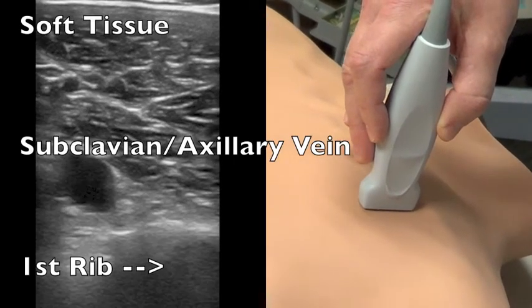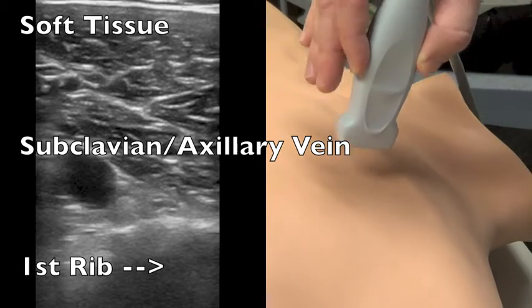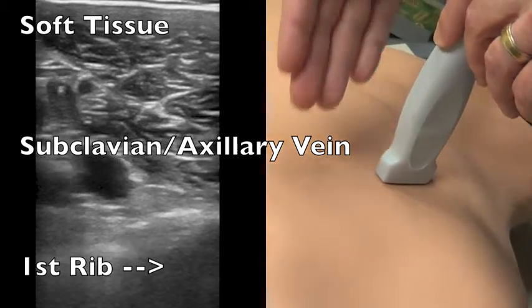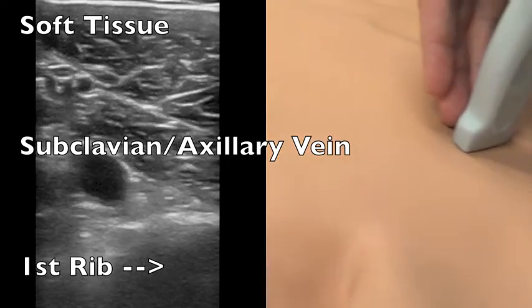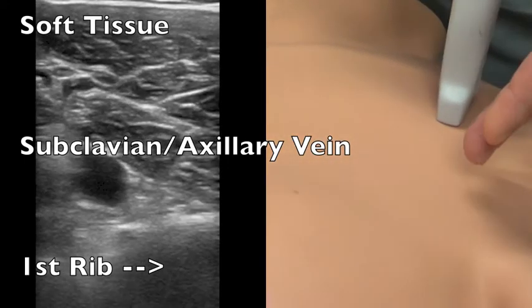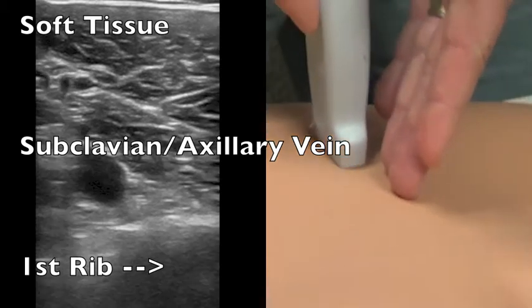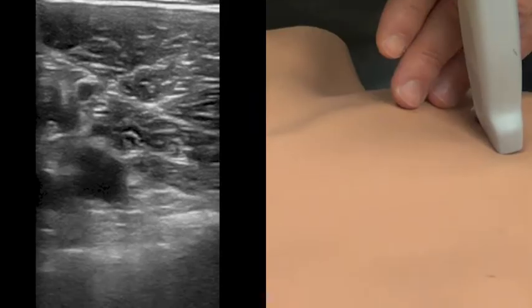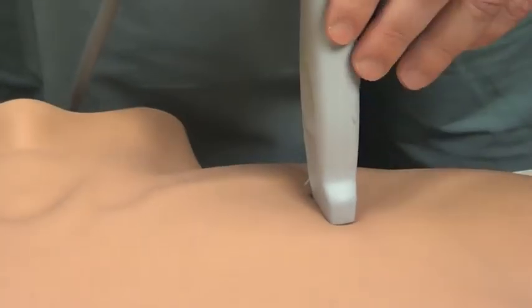I like to view the vessel in the short axis view and I usually end up with the probe in the infraclavicular fossa — in the area between the lateral aspect of the pectoralis major and the medial aspect of the anterior deltoid, creating a small triangle with the clavicle being the superior aspect of the triangle.